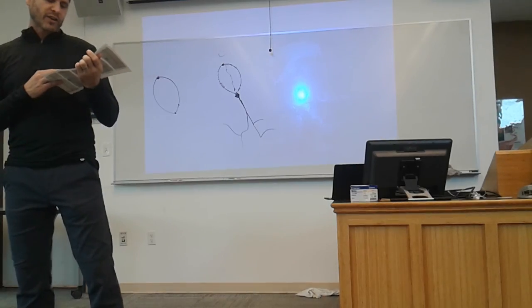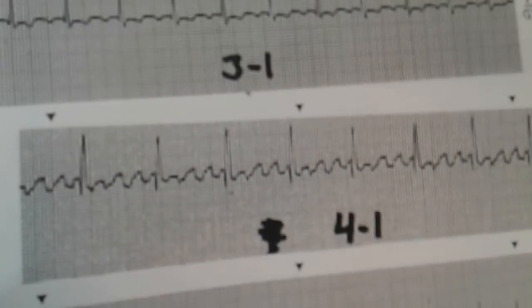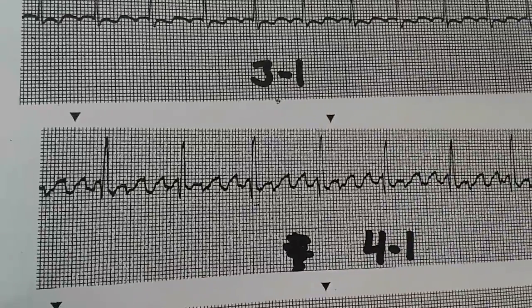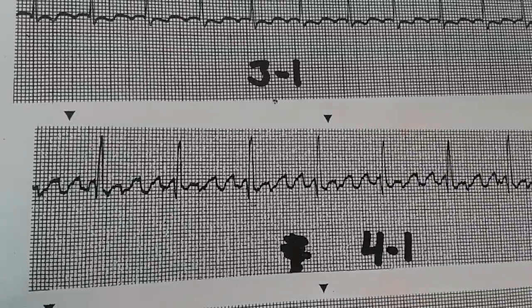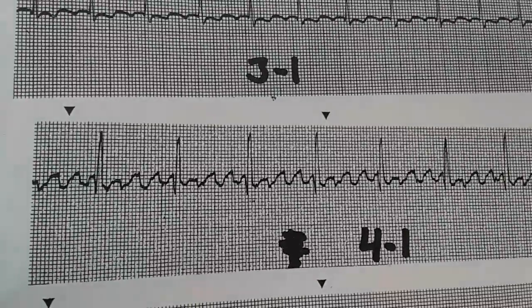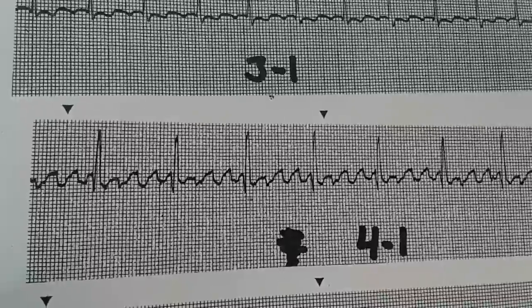You'll also note that the Q wave looks funky, because the QRS complex looks funky, because right at the beginning of it looks like there's something added to it, because there's no baseline leading into it. It looks like there's something funky at the beginning of the QRS complex. There's no PR. Exactly. And that's because there's another one right there too, right? Because we don't have any sort of baseline on them all. We just keep going and going and going.